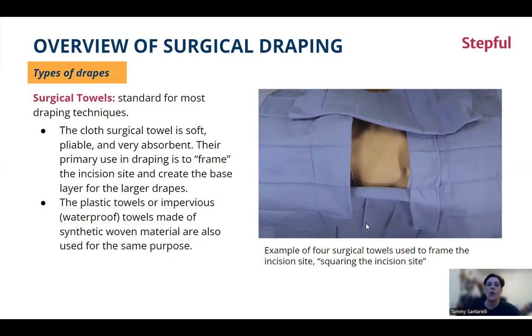Okay, so you see how it's cuffed. It's cuffed by about a fourth of an inch. And we would pass these to the surgeon. The first one, we'd walk around and give it to the surgeon. This is where the surgeon would be right here. They would put it down, then we would pass the left, the right, and then the last one would be on our side, and the surgeon would put it on. And you notice how it's cuffed, and it will just go flat. Okay, it's another line of defense for sterile technique.